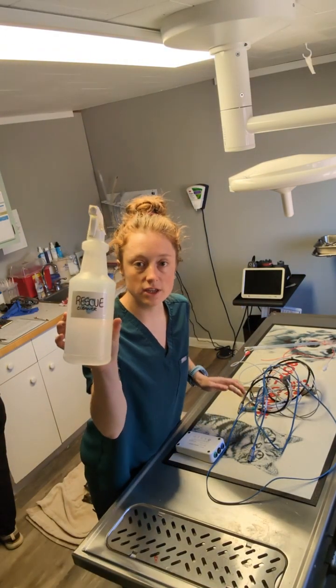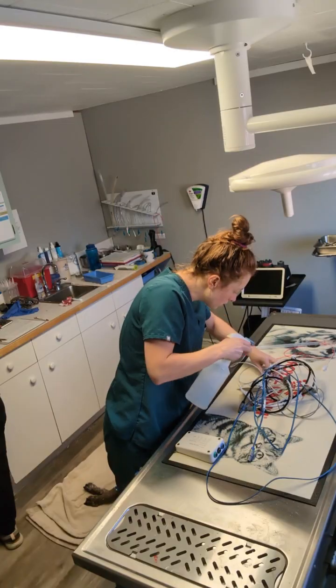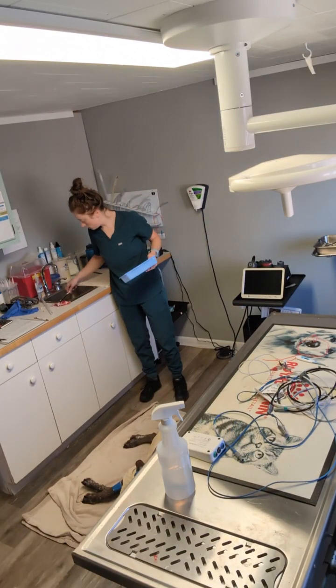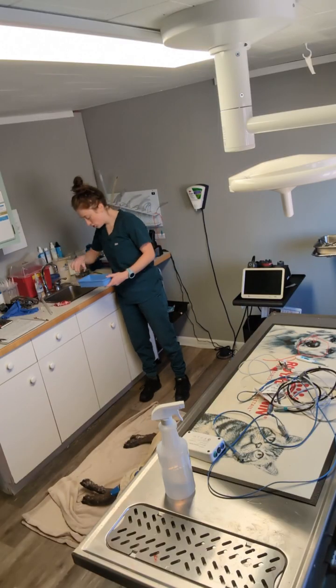So I've got Rescue. And then all the surgical utensils, I'm going to put in just a dish.